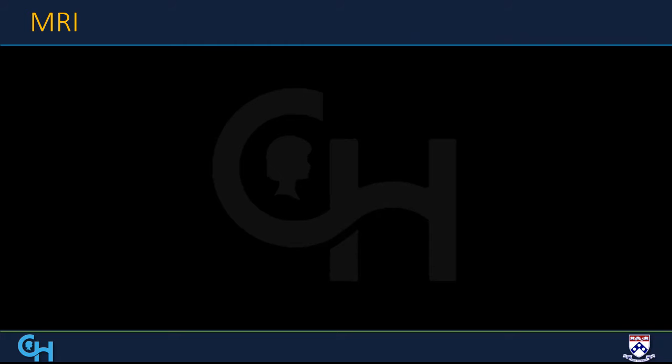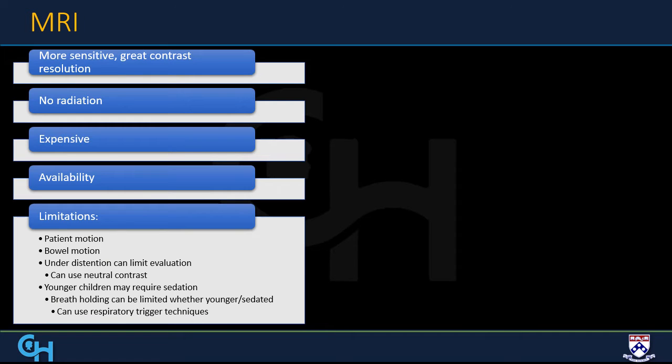Okay, lastly, we're going to go over MRI. So MRI is more sensitive and has great contrast resolution, and the biggest benefit is it involves no radiation. Big downside is that it can be expensive, and there can be limited availability.